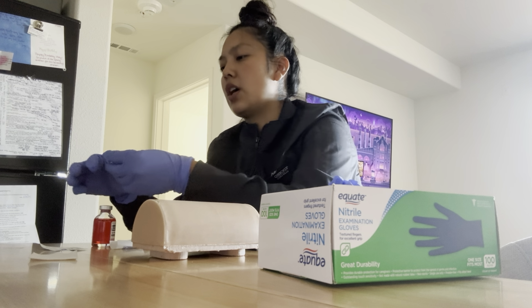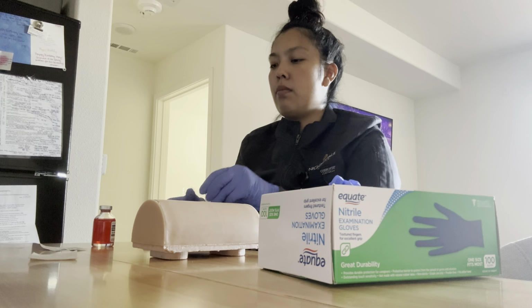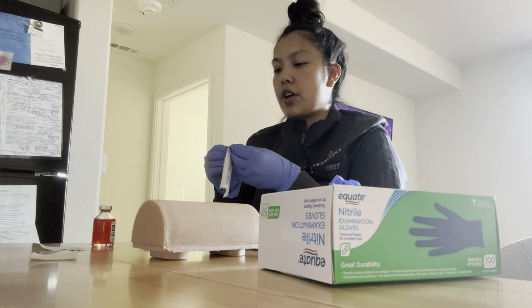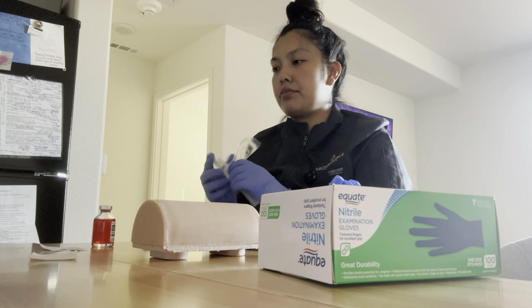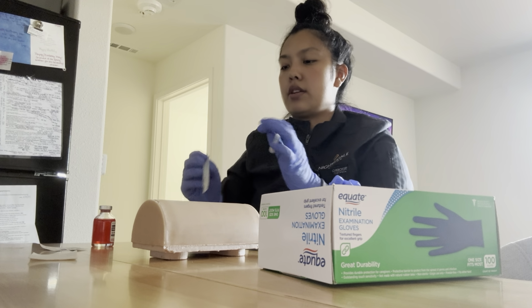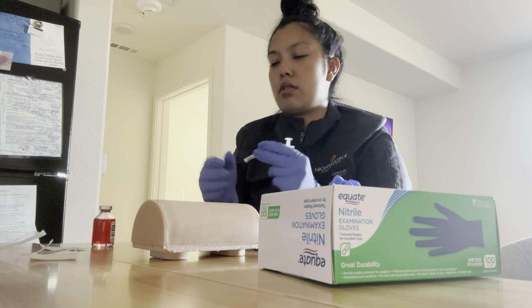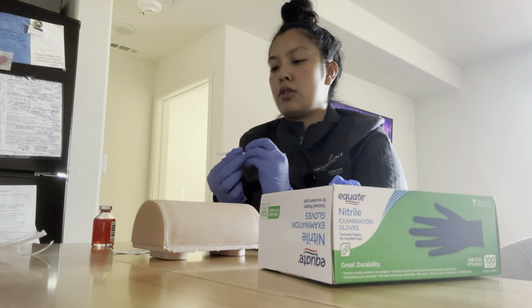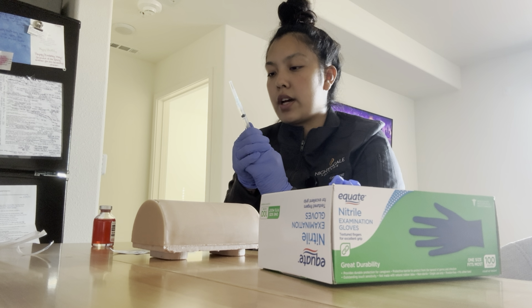I'm going to open up my alcohol prep pad. I'm going to wipe this off, toss that. While that is drying, I'm going to open up my syringe and get my needle ready. Toss that, like that, and then I'm going to inject the air to 1.5.